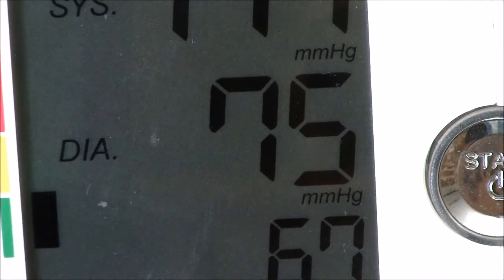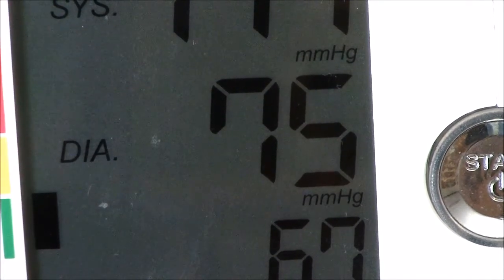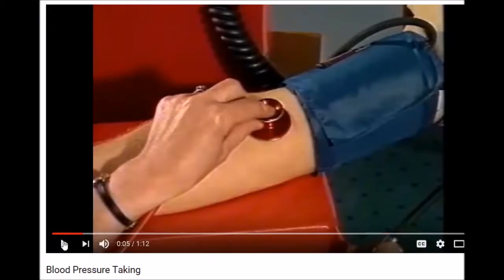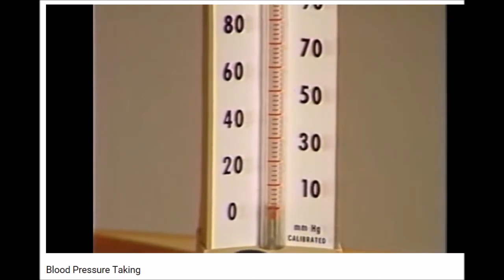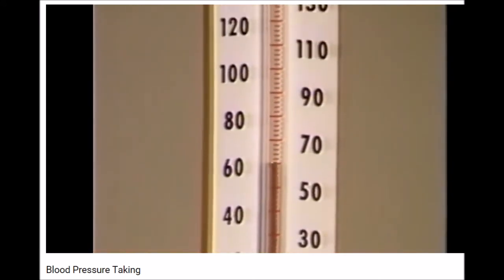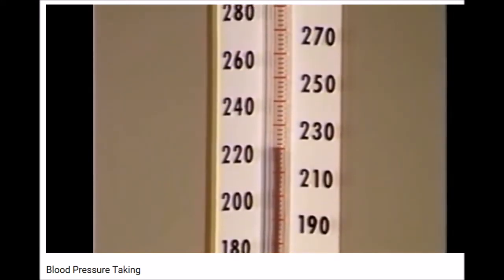I will show you that in the old days it was not a digital readout, but was instead an actual column of mercury that you could watch. So here's what it would look like in the old days. You'd have a stethoscope listening for the heartbeat near the elbow, and you'd pump the mercury up. So this is liquid mercury. You can see it going up now as the pressure increases. So this is used to measure the pressure in the cuff.